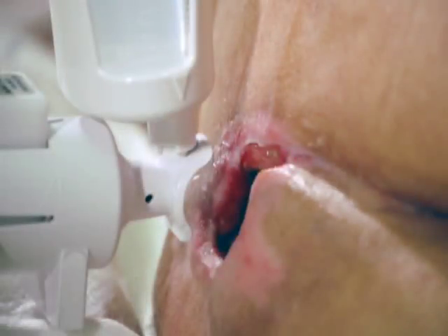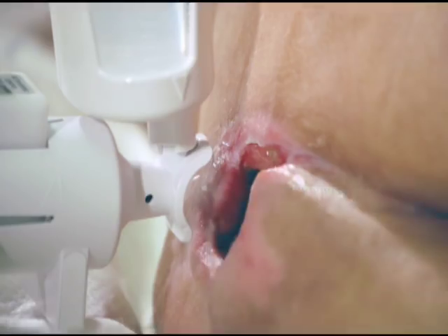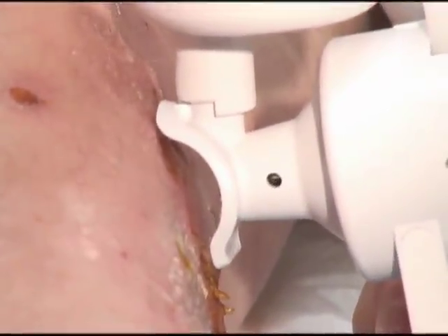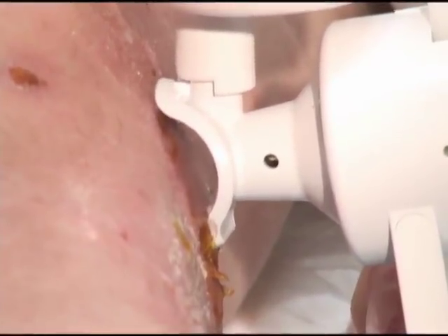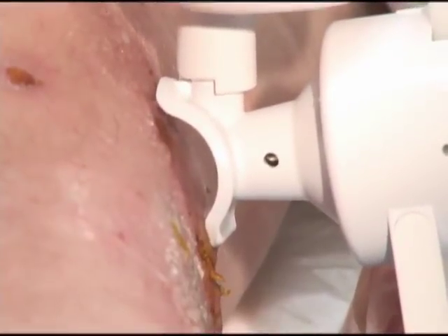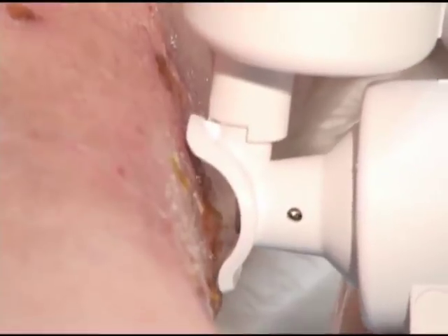The treatment head should be held so that it is perpendicular to the wound, with the leading edge of the applicator approximately 0.5 to 1.5 centimeters from the wound. A simple rule of thumb is to be as close to the wound as possible without touching the applicator tip. This is important to ensure the ultrasound energy reaches the cells within and below the wound bed, and the close proximity allows the saline mist to gently bathe the wound bed.